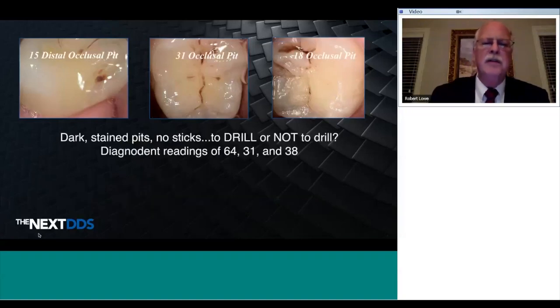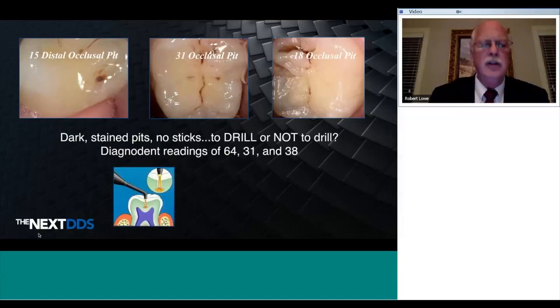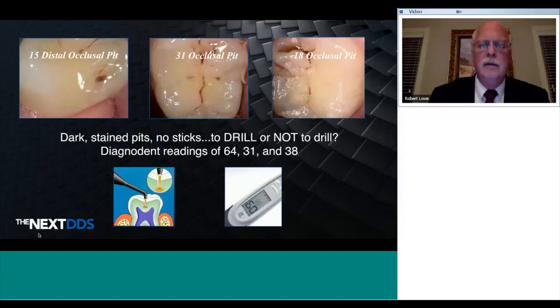Dark stained pits, no sticks, drill or not to drill. Now, DIAGNOdent is something that's been around for a long time. It measures the degree of decalcification. It's a quantification of decalcification. DIAGNOdent has been available to the profession for probably about 20 years, yet when I ask how many people are clinically using it, I would say maybe 10%. A reading over 30 indicates decalcification.